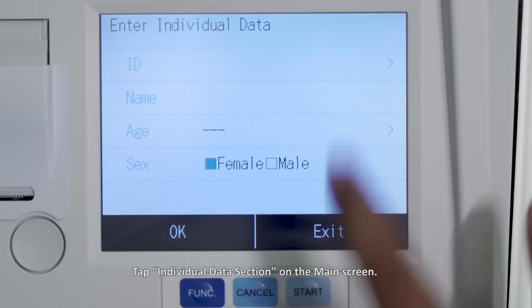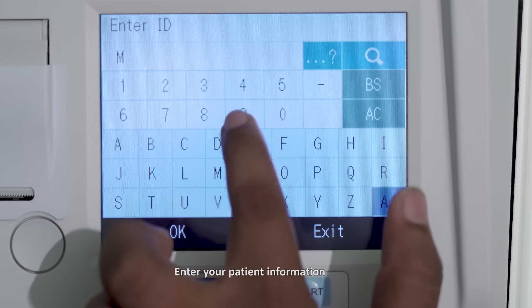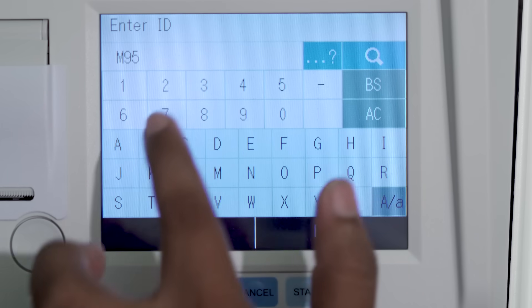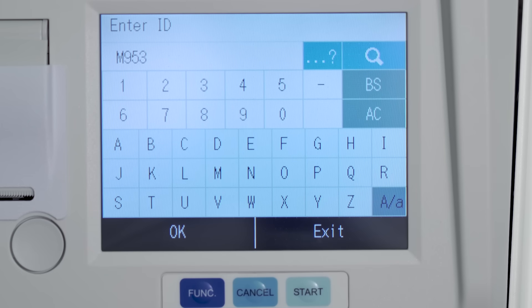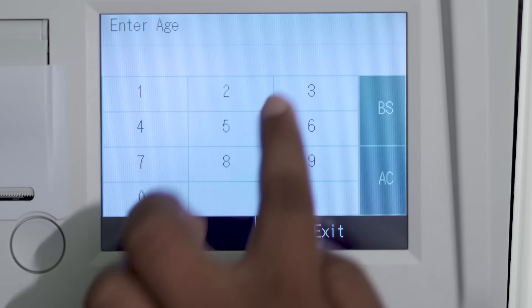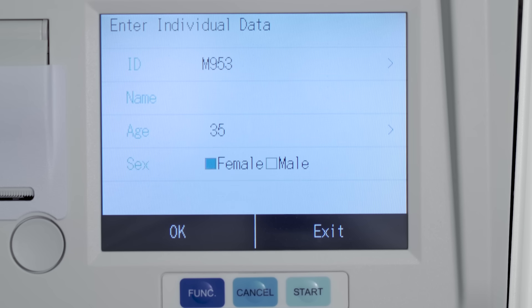Tap the individual data section on the main screen. Enter your patient information and then tap OK.